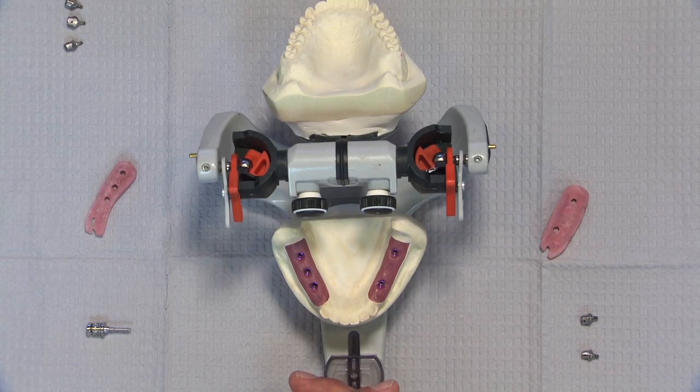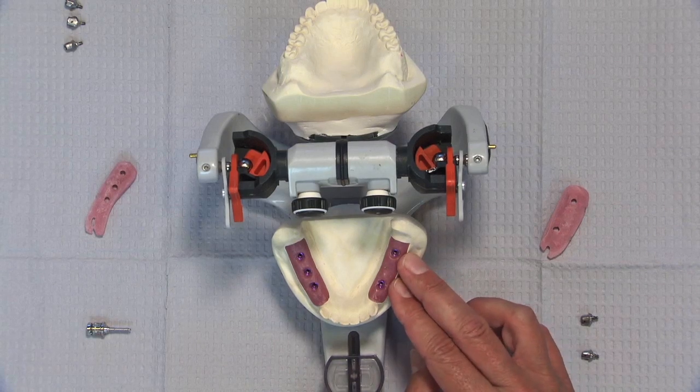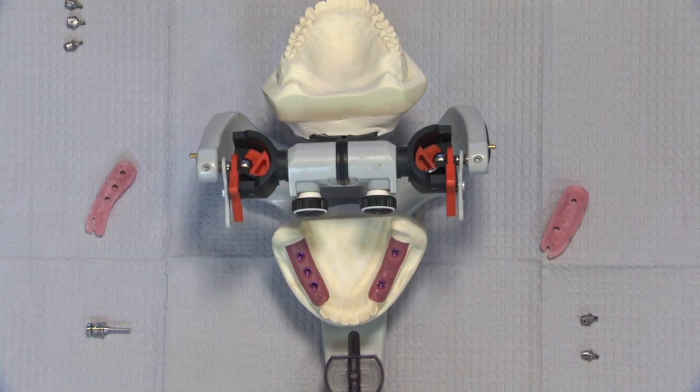In a case like this, I'm a big fan of custom abutments, especially on this side here where we're doing a bridge. I just don't think there's any way to beat custom abutments when we're going to have a bridge in terms of draw, in terms of support structure for the bridge itself. I think this is just a great use for custom abutments. So the laboratory has now sent us back a couple of custom abutments along with our positioning bite index. Let's take a look at how we're going to use this.